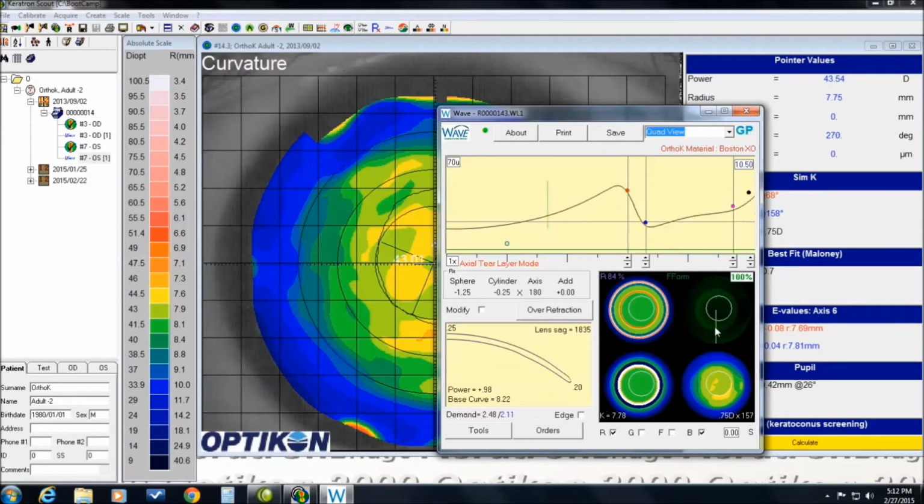When we look above and below, we see where the tear layer is, but we're still pretty much in alignment, pretty close. I don't obsess over microns. I look for the quality of the design. So when I look at this, I think, well, this might push my lens off center, so I'm going to raise this up a little bit until this point right here has a tear layer of about 5 or 6.